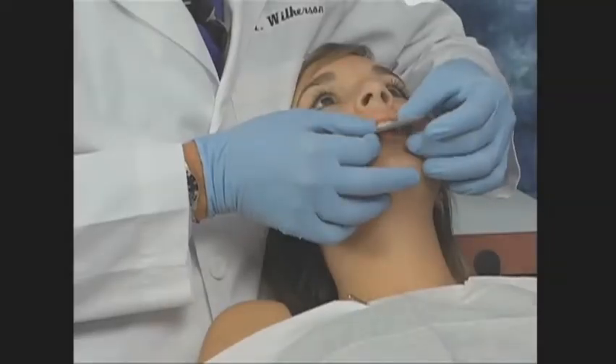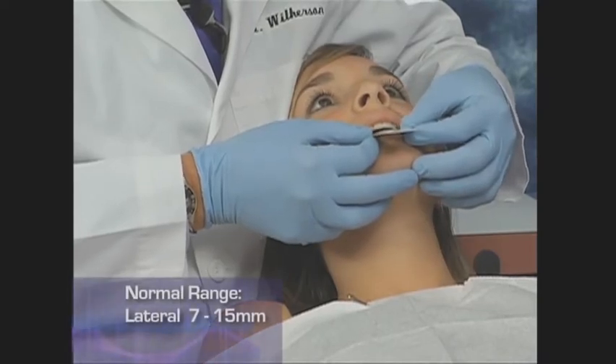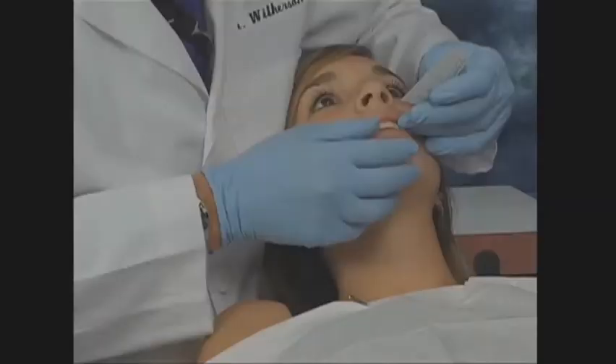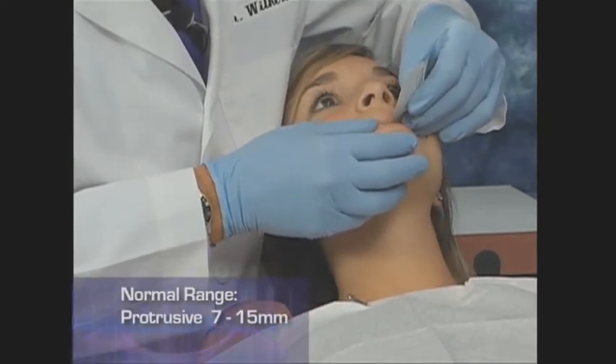The flat edge of the scale is used to measure lateral movements. Place the zero line on the lower central midline and have the patient move all the way to the right. Use the upper midline as the measurement on the ruler. Normal lateral movement is 7 to 15 millimeters. Measure the left side as well. You can also measure protrusive with the flat end; normal protrusive is also between 7 to 15 millimeters. Watch for deviation of the mandible to one side or the other upon opening, as this can indicate disc displacement in that joint. Since the scales are disposable, they can be included in the patient's chart and compared to new readings as the patient proceeds through their treatment plan.